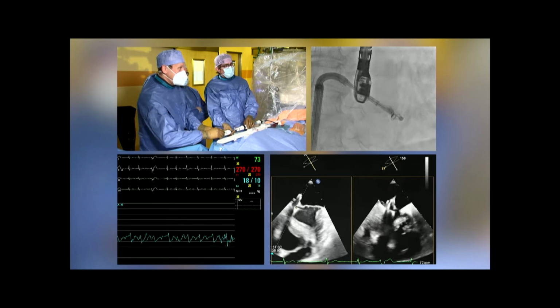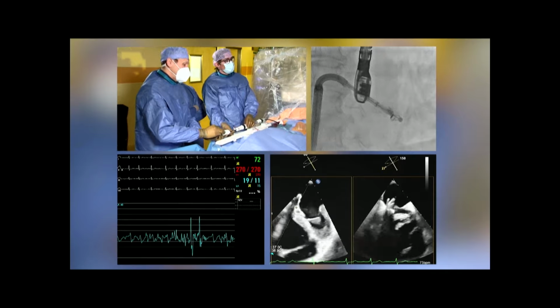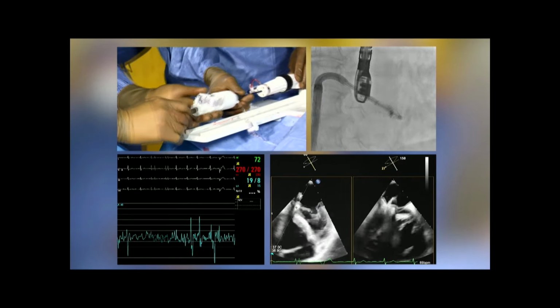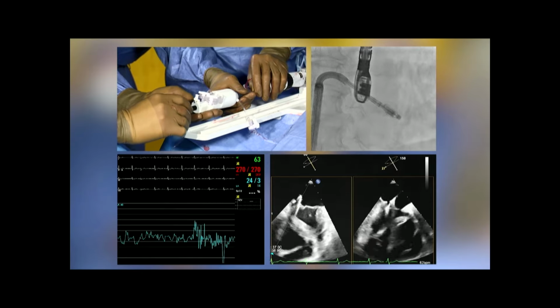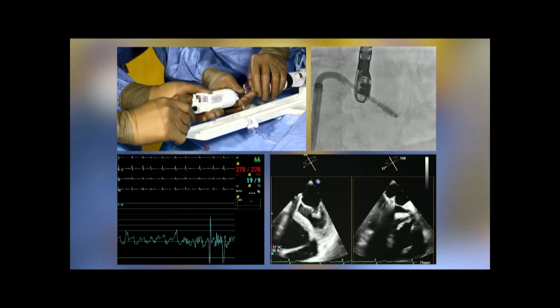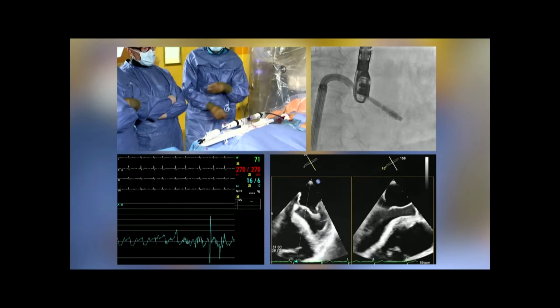Okay, let's bring them. Now we can do it simultaneously because they're very nicely on. Yeah. So we bring down the clasps and we close the device and move in a little bit. Device is closed. All right. Breathing on, and then we discuss everything.